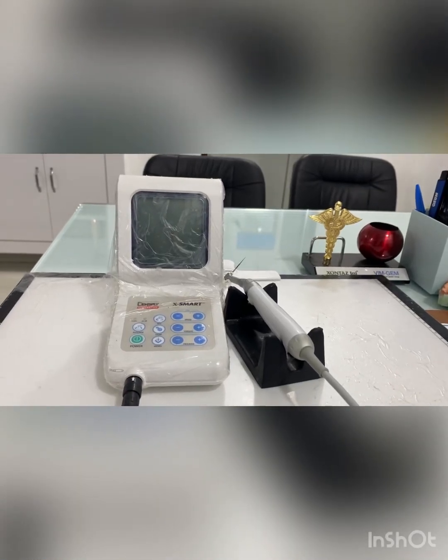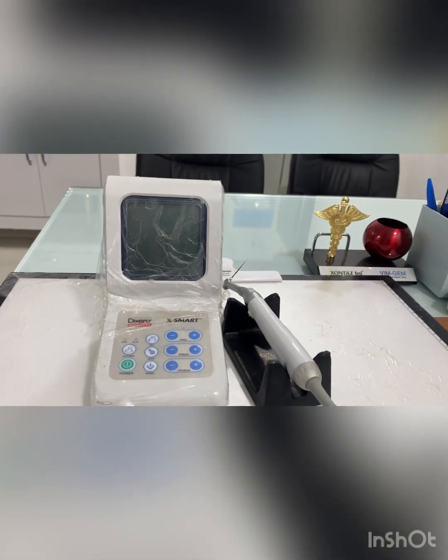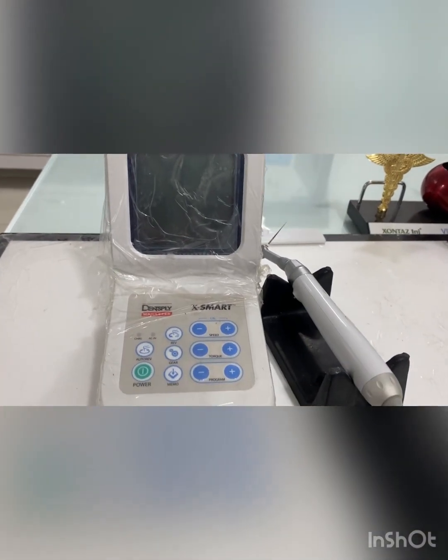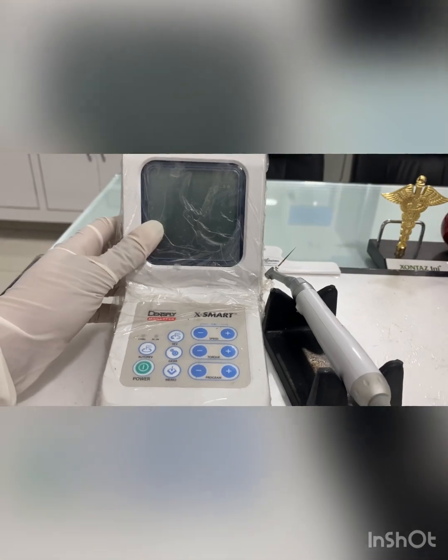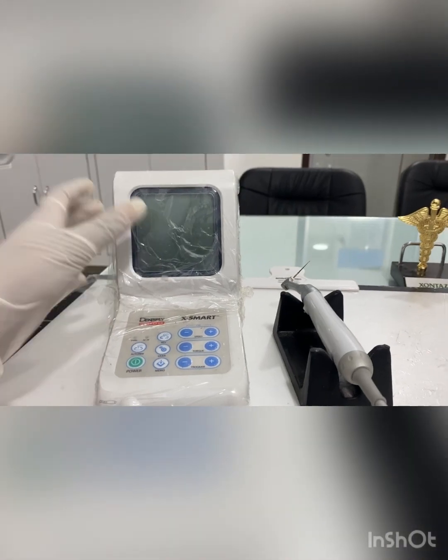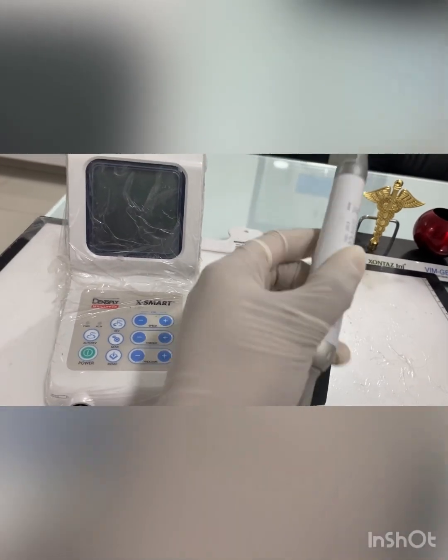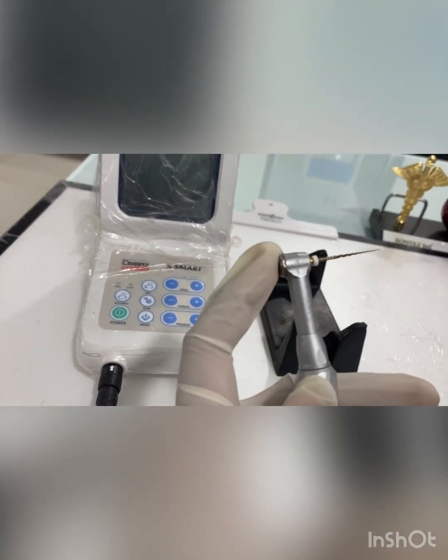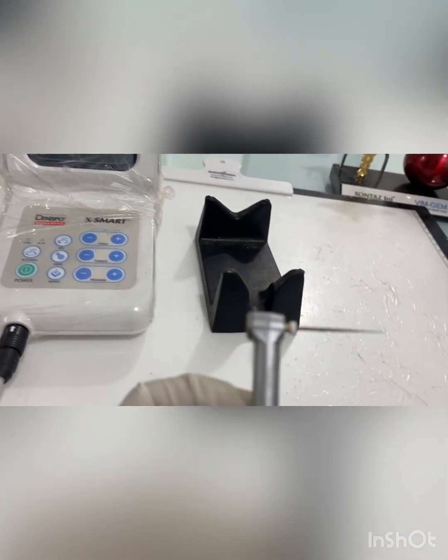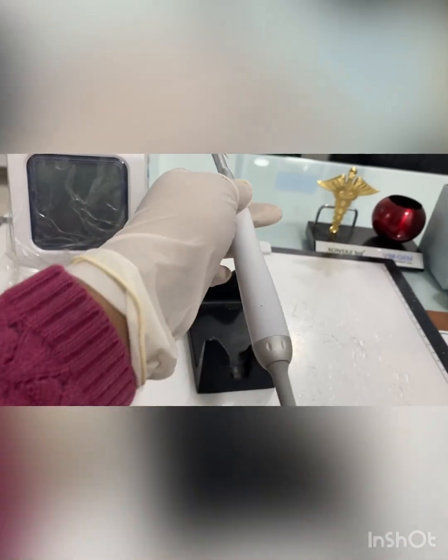Welcome back to Easy Dental by Dr. Asmat. Today we'll discuss the endomotor — specifically the X-Smart endomotor from Dentsply. Let's start with the parts: this is the control unit, this is the handpiece, this is the handpiece stand, this is the contra angle, and here you can see a file has been inserted.